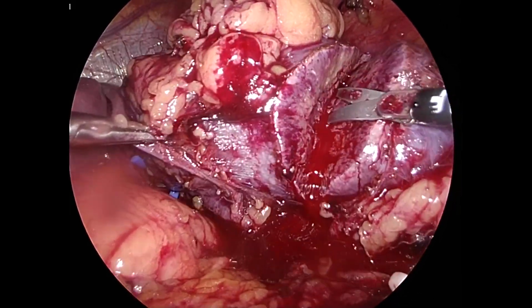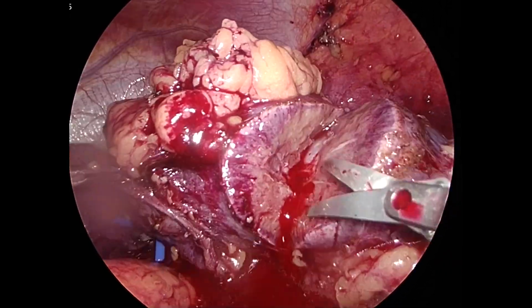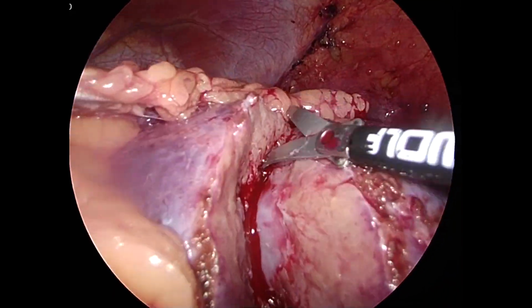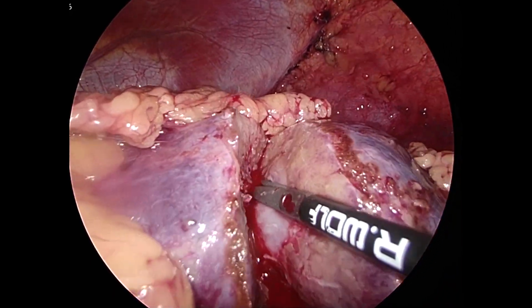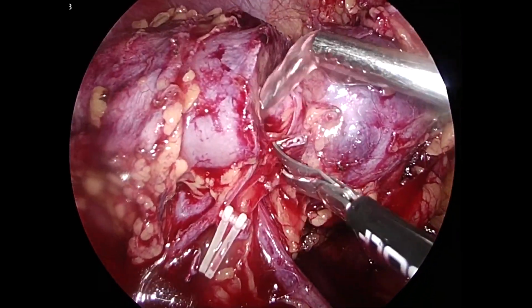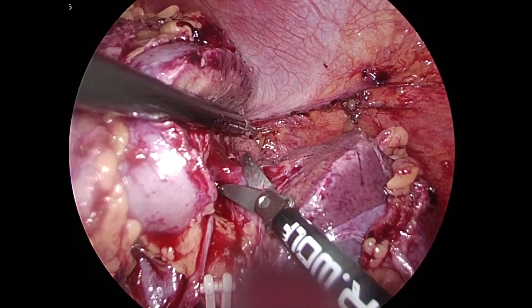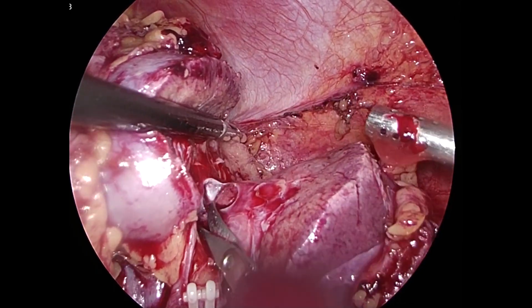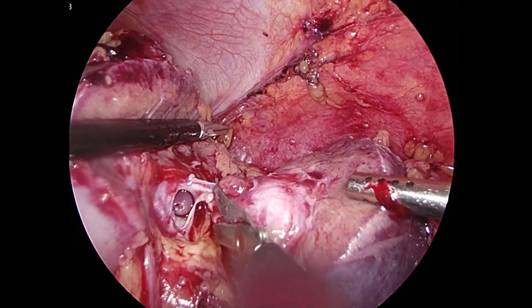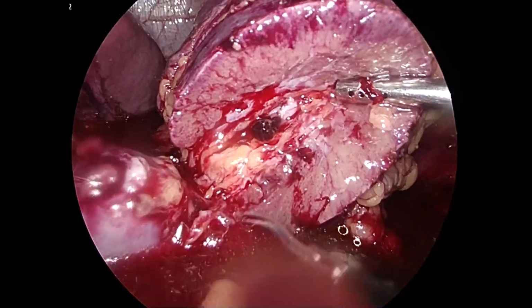During tumor resection, intermittent saline irrigation from the assistant port helped in delineating the peritumoral plane. Medially, the plane of resection was just adjacent to the ligated ends of the lower polar vessel. This helped us in clearly delineating the plane of enucleoresection. After cutting through the lower polar collecting system, the rest of the tumor was resected from the renal parenchyma.